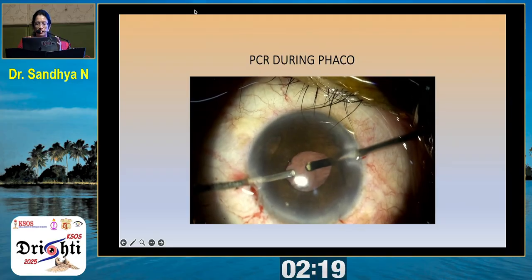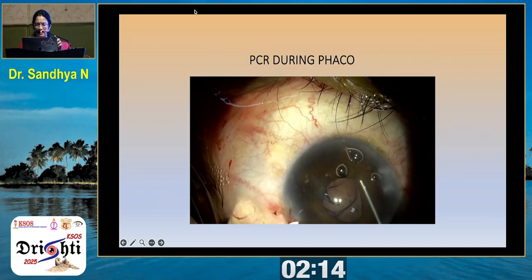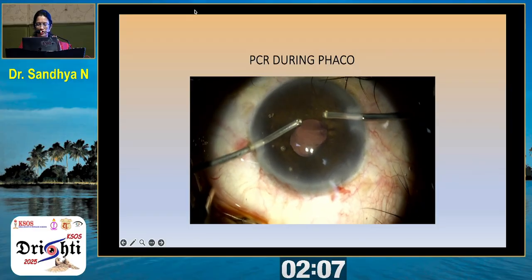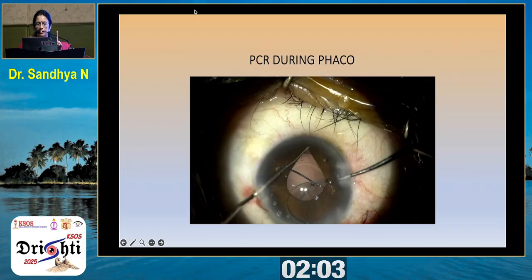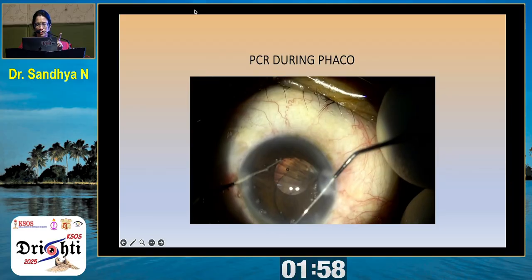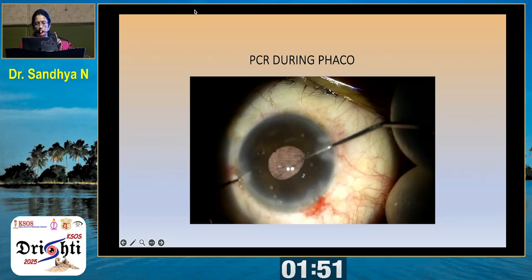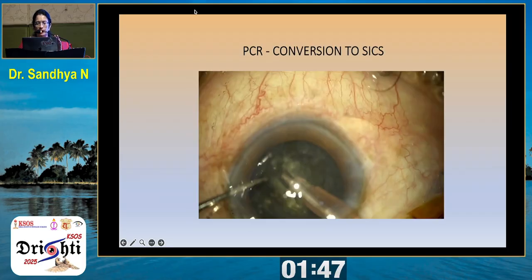Now then, during vitrectomy, the pupil came down, and here again there was a strand of vitreous there, which was indicated by the pupillary peaking, and an iris repositor was used to swipe across the pupillary margin, and the remaining strands were also removed. Now we had to place a 3-piece lens in the sulcus. So visualization of the rexis margin in this case is very important, because we already have a PC rent, and then a Kuglen hook was used to retract the iris for visualization, and the 2 haptics were placed on the rexis margin.